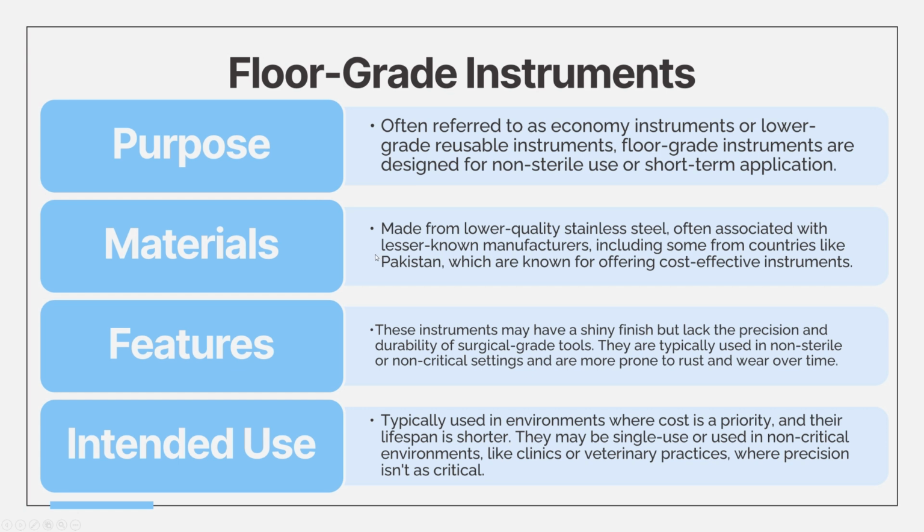And so now we're going to look at the features. They have a shiny finish but they are less precise and durable, which makes them prone to rust and wear. Intended use, they must be used in a cost-sensitive, non-critical environment like clinics or, like I mentioned, the less critical departments of any healthcare facility.